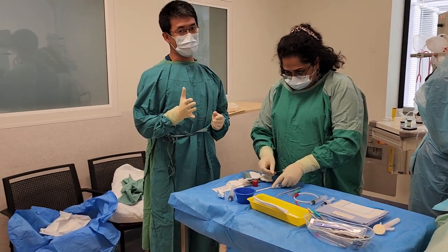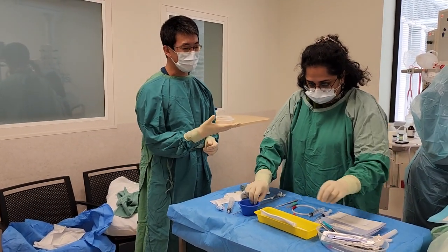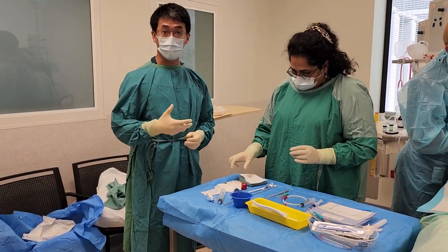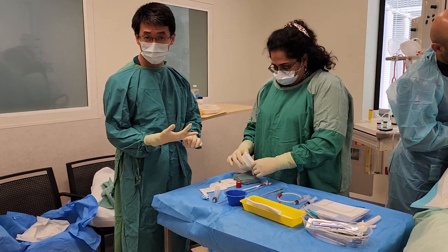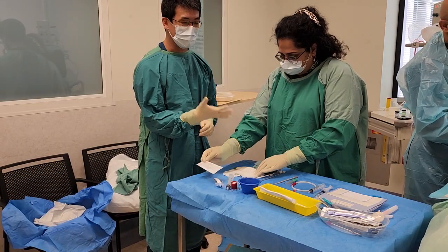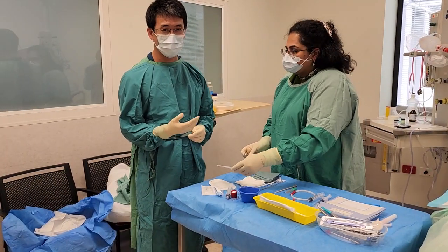Right, so this is a bedside teaching of a pigtail chest drain insertion. With me, I have our first year ED registrar. And in this exercise, we're going to go through the indications and contraindications to putting in a chest drain, some of the steps and procedures and equipment that we need in order to successfully put in a chest drain, and some of the complications. Unfortunately, we don't have consent from the patient because he's too drowsy.